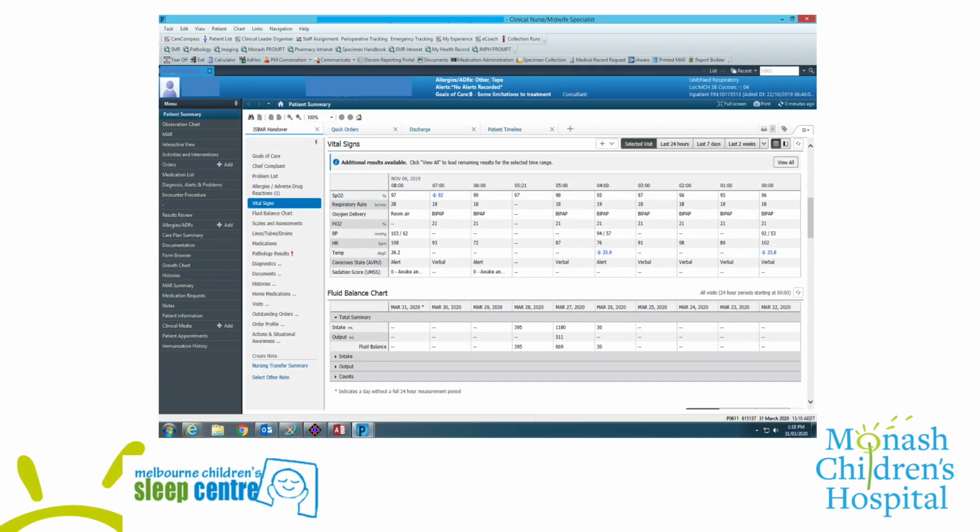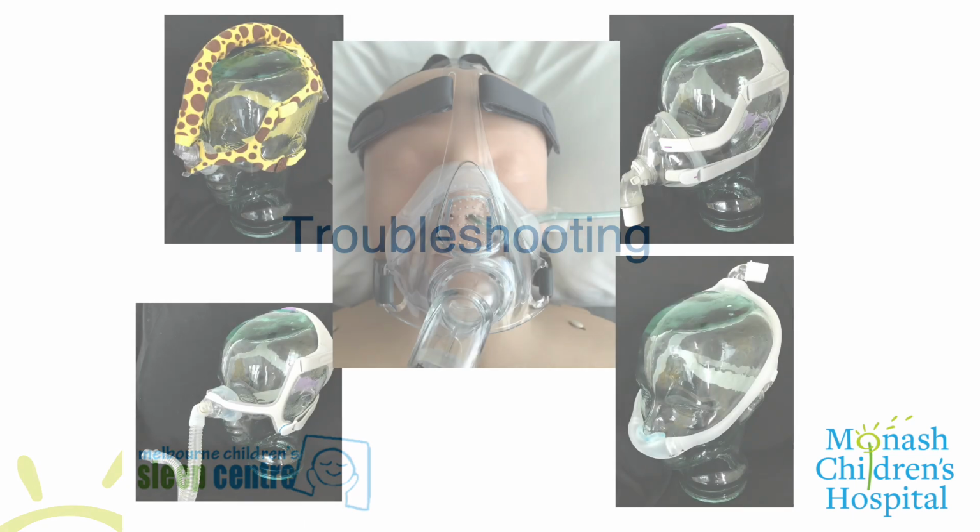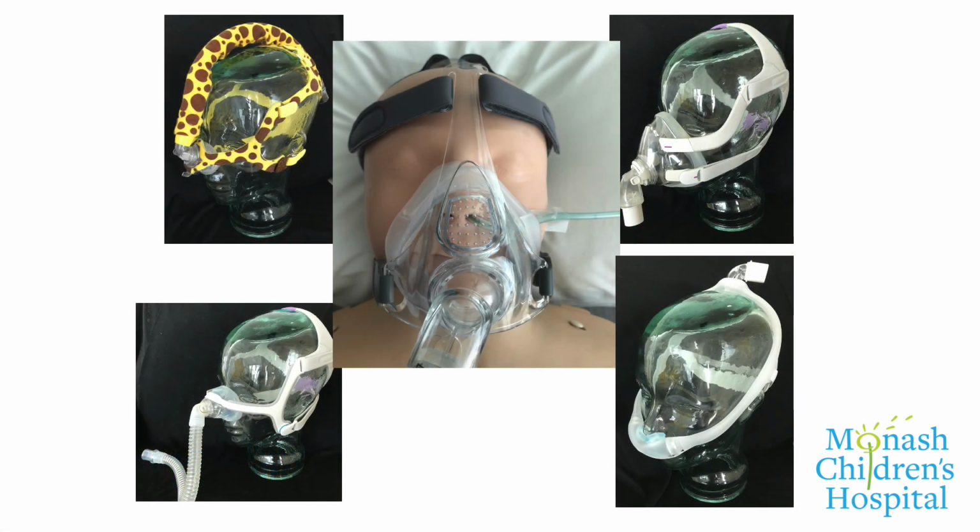Assess clinical status, including oxygen saturation. Regular blood gases will be needed to assess PCO2. Medical prescription is needed if changes to treatment settings are required. The choice of mask may need to be revised if leak is excessive.